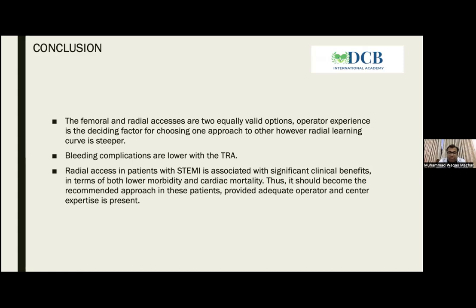Radial access in patients with STEMI is associated with significant clinical benefits in terms of both lower morbidity and cardiac mortality. Thus, it should become the recommended approach in these patients, provided adequate operator and center expertise is present.